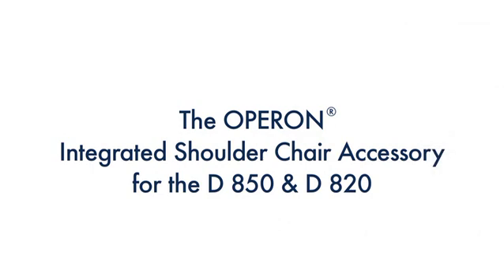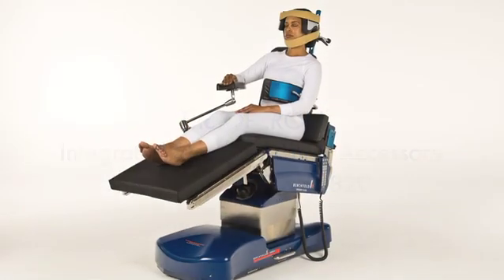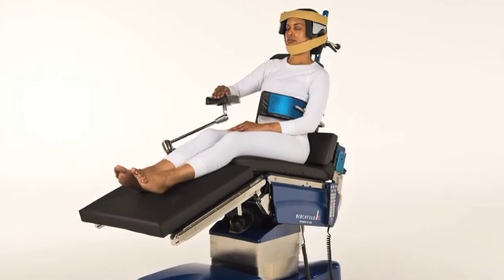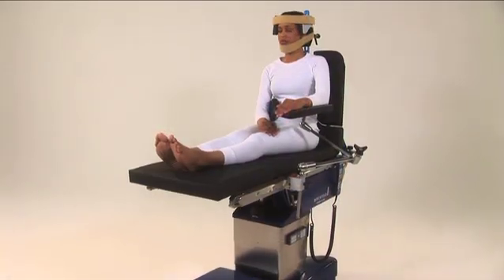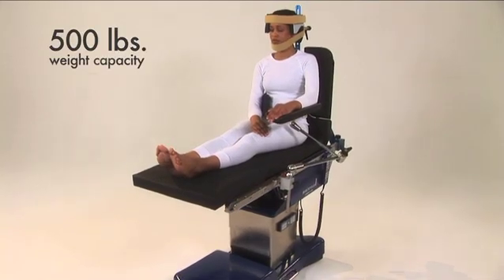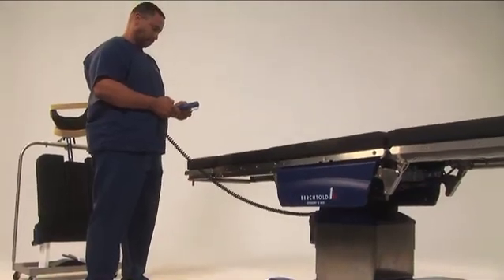The Operon Integrated Shoulder Chair Accessory for the D850 and D820. The Operon Integrated Shoulder Chair offers optimum surgical access to the patient's shoulder area. The patient weight capacity of the shoulder chair is 500 pounds.